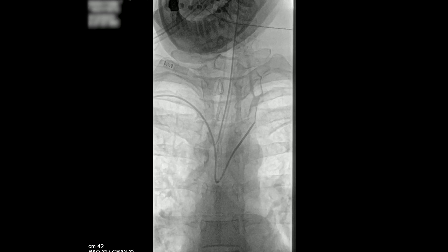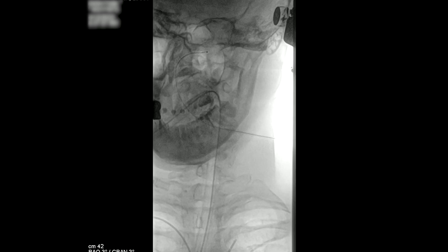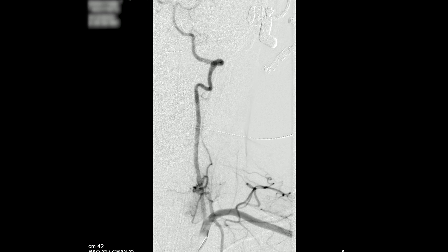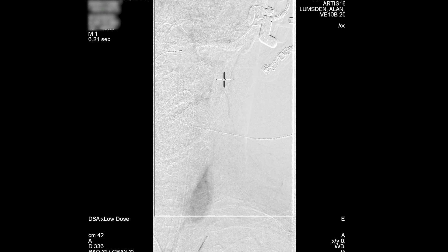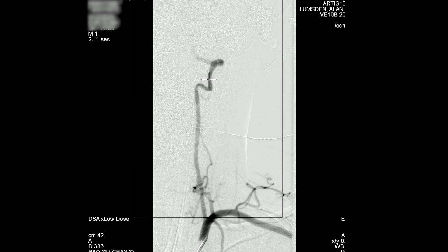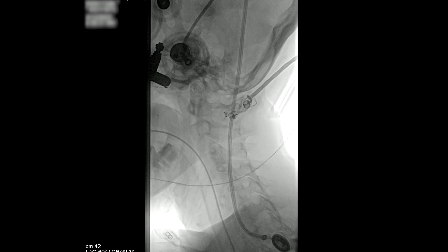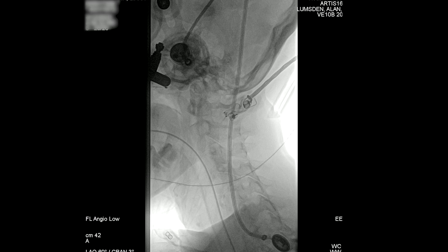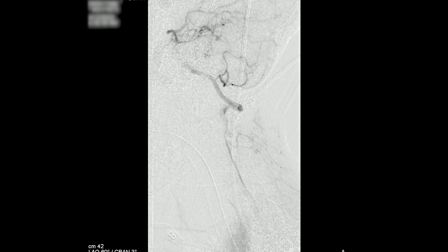With a combination of rotation it looks like we're already in the left vertebral artery — and indeed the left subclavian. You can see the left vertebral artery filling nicely. We're still injecting somewhat non-selectively into the vertebral and the subclavian artery at the same time. There's the lateral view.